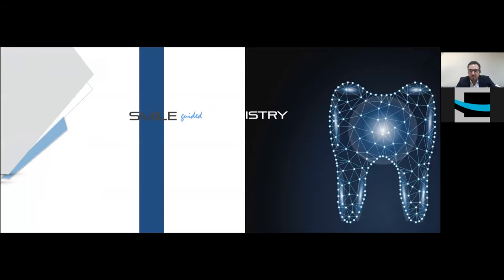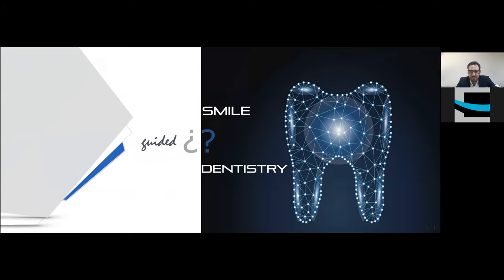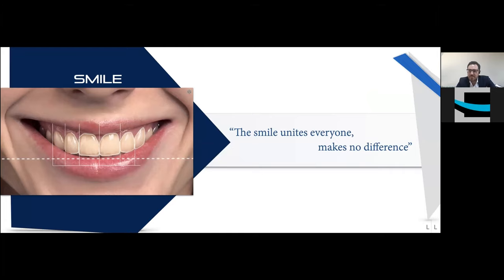The core of our workflow is well represented by this principle, smile-guided dentistry. Normally, the word guided is adopted in a surgical context, but we are firmly convinced that the smile is the first factor to consider when a patient asks for a clinical consultation. The smile unites everyone, even our patients. It is difficult to imagine a patient who can accept a treatment plan that does not put aesthetics in evidence, but that is just functionally perfect.